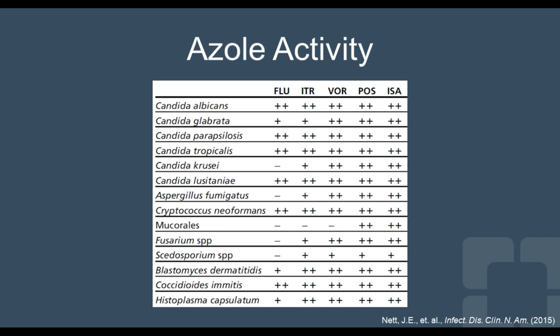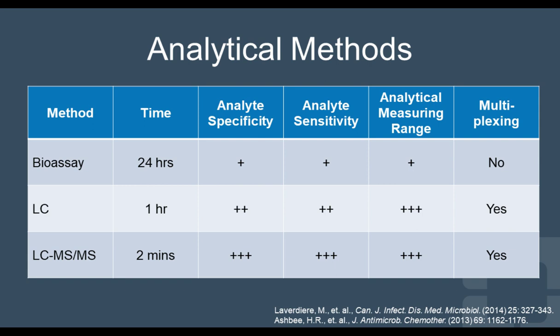If your hospital has decided that this is important because you have a large transplant population and the turnaround time needed to adjust dosages is not being achieved by reference laboratories, you could bring this method into your lab. If you decided to do so, a review of the literature shows different methodologies available.